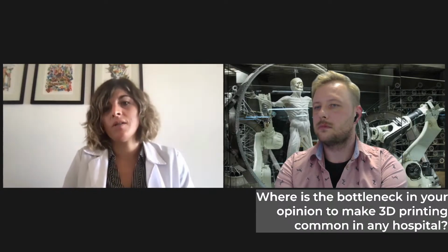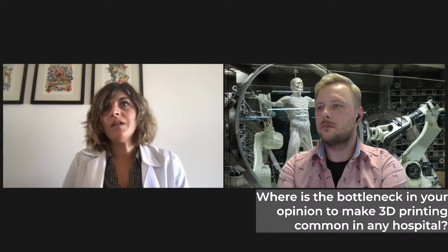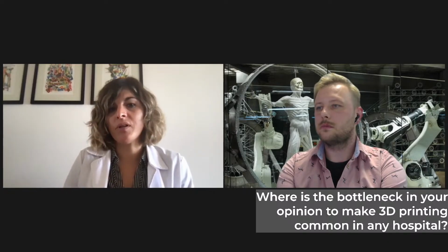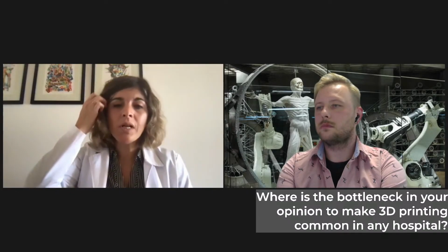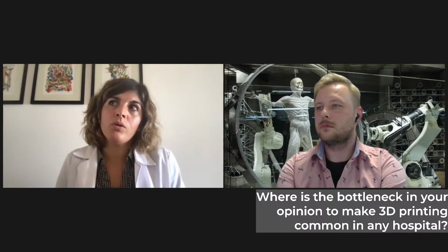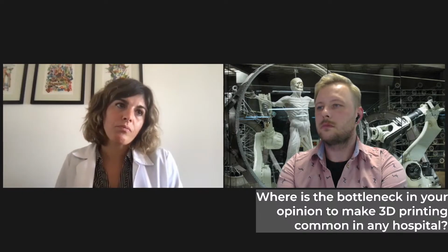So for those patients that need 3D printing, now I think hardware for 3D printing is every day more affordable for the different hospitals. So I think the bottleneck sometimes is getting people trained to create the 3D models and to print the 3D models.